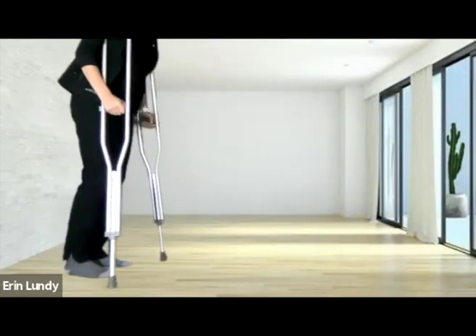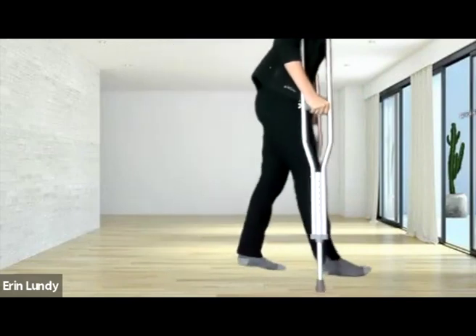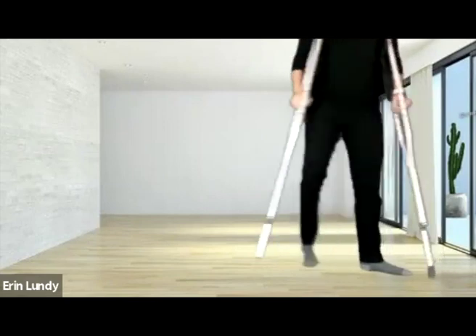Now, one of the techniques that I like to use a lot is called 4-point gait. This is where you're trying to reintroduce a little bit more weight bearing into your kid's legs, but you don't really want to go full in. Again, your therapist will advise you on this. This is 4-point gait, where you have 4 points on the ground the whole time. I always think it sounds kind of like a horse walking: da-da-dunk, da-da-dunk, like that. So here's what it looks like. I'm standing here. I'm going to move my right crutch forward, followed by my right leg. Left crutch, left leg. Right crutch, right leg. Left crutch, left leg. And I can move forward like that.